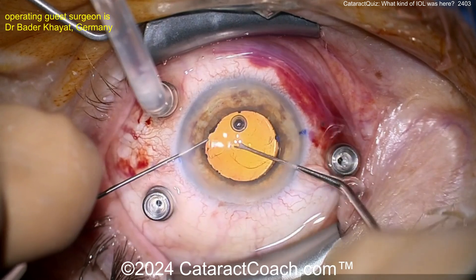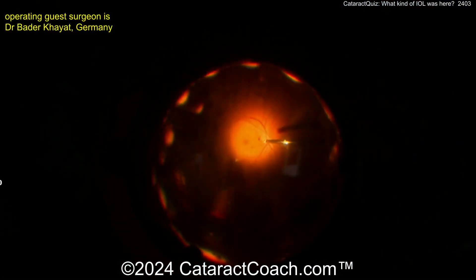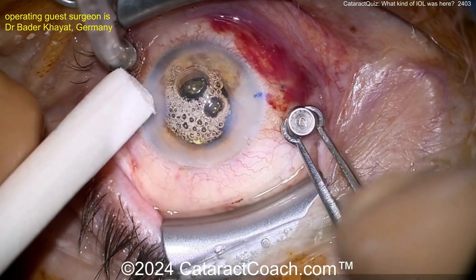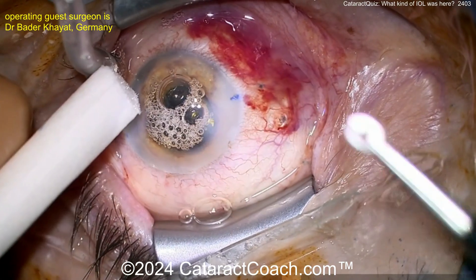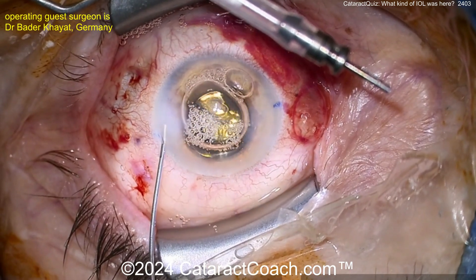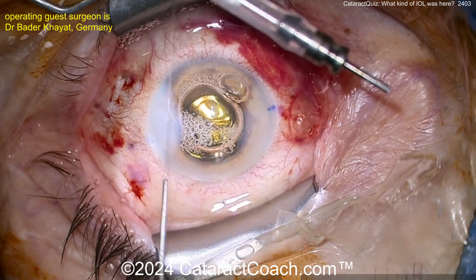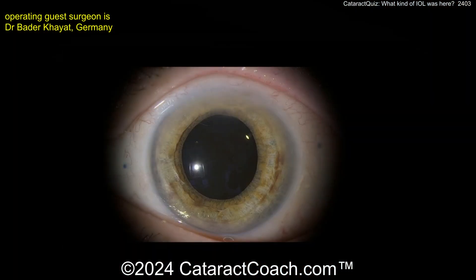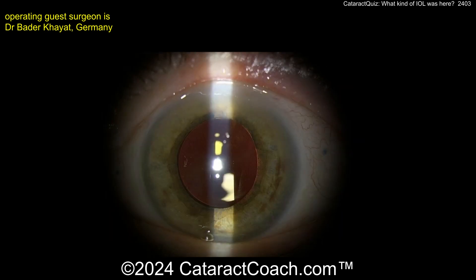The lens looks beautifully centered — wow, neat case here. Looks like an air bubble going in there, a little more retina work, and end of the case taking out the trocars. Post-op looks good — the lens is going to be beautifully centered and very stable for this patient. Post-op pics look great — beautifully done, wow, fantastic!